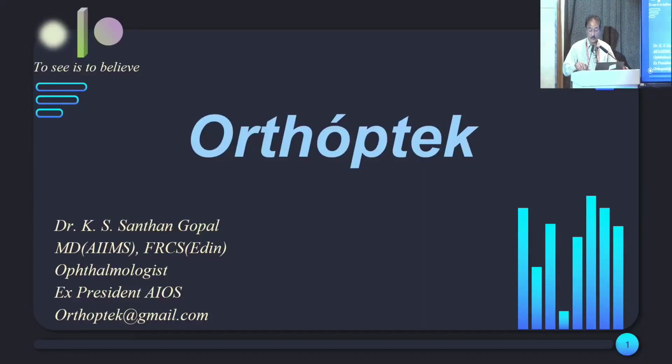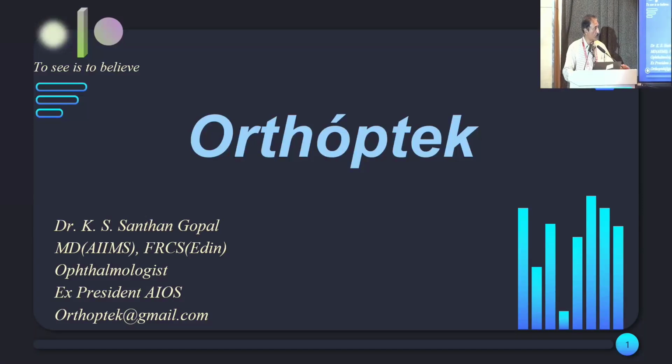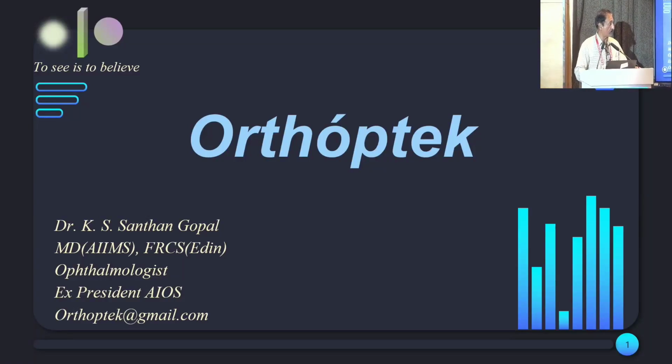Good morning. I don't know how many of you are aware of Orthoptek, but it is a simple instrument which is based on the fact that when M cells and P cells are sequentially stimulated, it leads to stimulation of occipital cortex, frontal cortex, and parietal cortex.